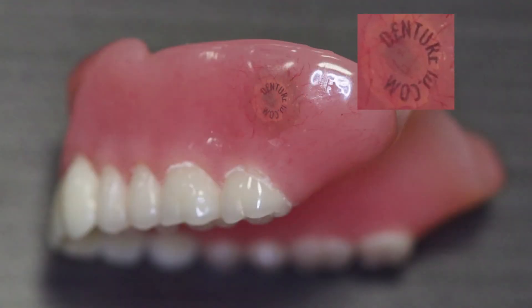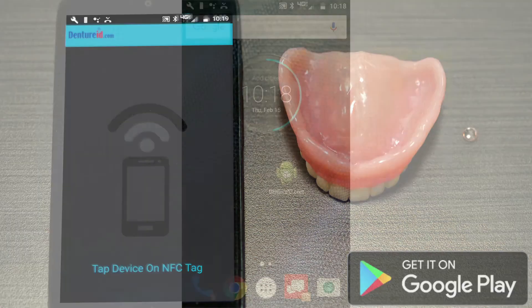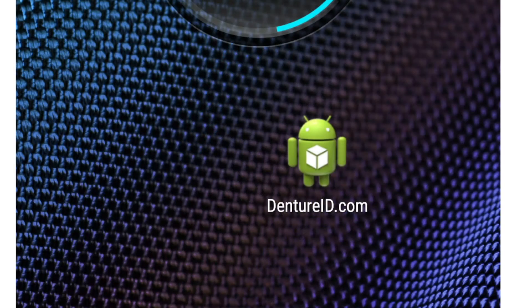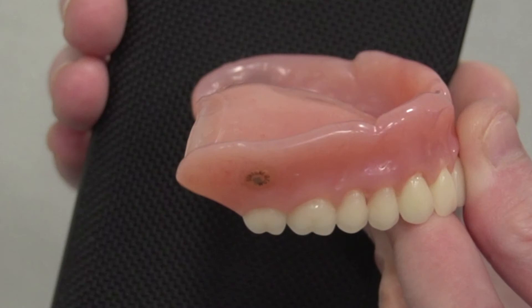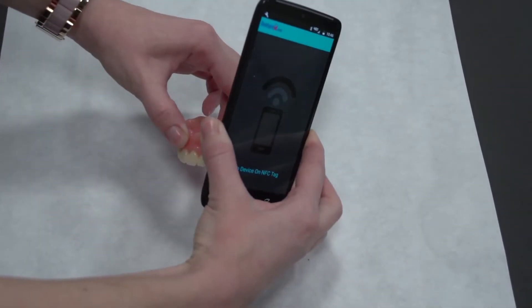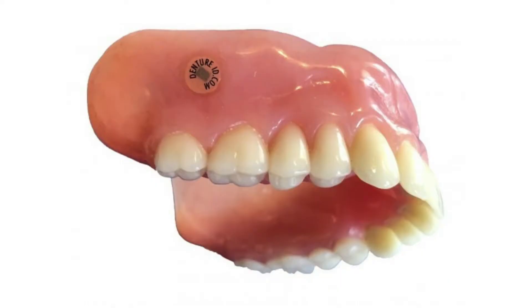The DentureID Microchip can be read using any compatible Android smartphone in NFC mode after downloading the DentureID.com app from Google Play and holding your phone within one-quarter inch away from the microchip. The microchip is passive and does not emit any signal until powered by a compatible Android smartphone. DentureID.com microchip is not a tracking device — it cannot help you find a denture that is lost. However, it can help someone who finds it to locate the owner.